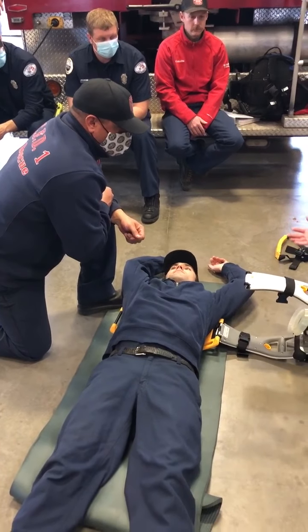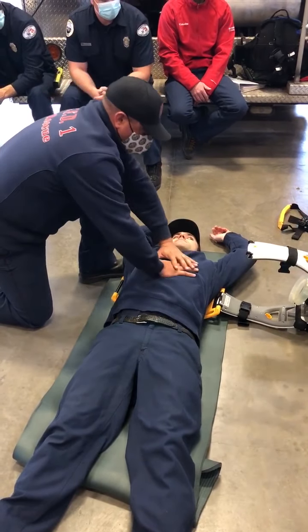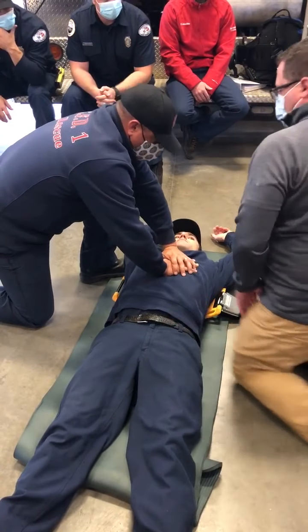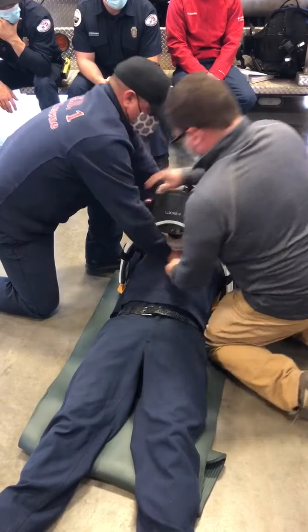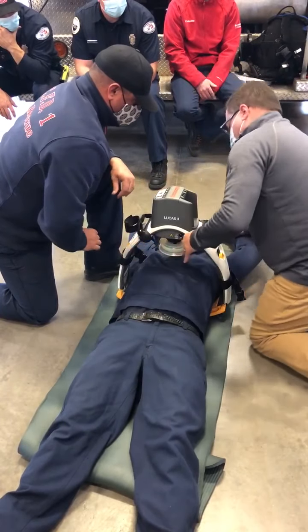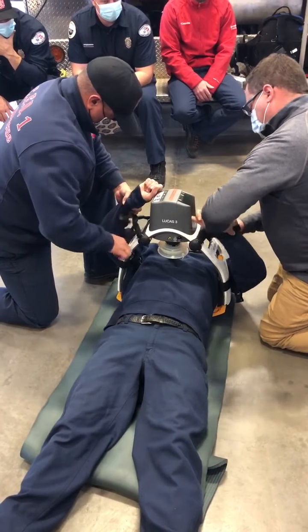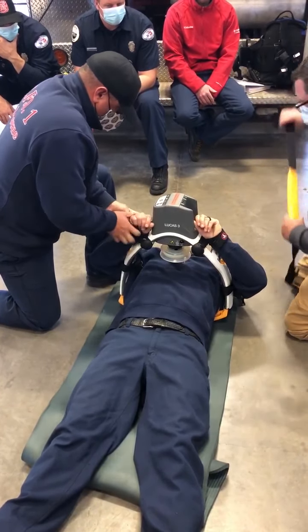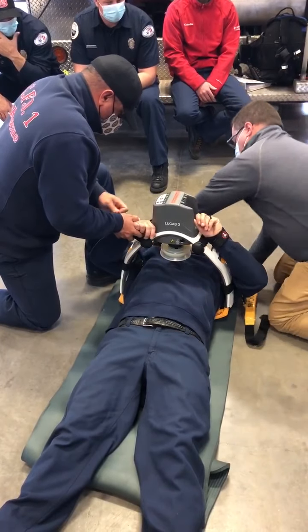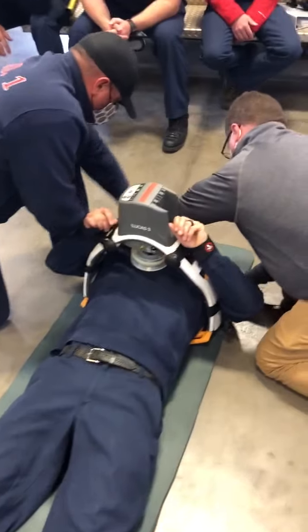But we're going to do the same thing. Coming up on our pause on minute 6 now, and I've been helping him push drugs. I've been helping him do other things. What we're going to do is coordinate. 5, 4, 3, 2, 1, 1000, 2, 1000. 1, 2, 3. Good job.